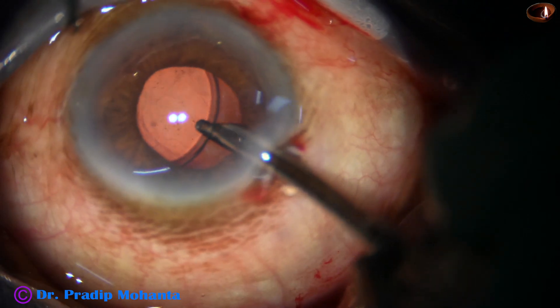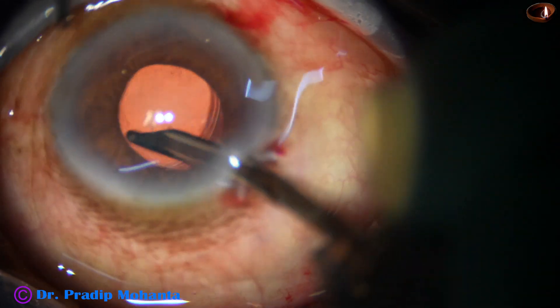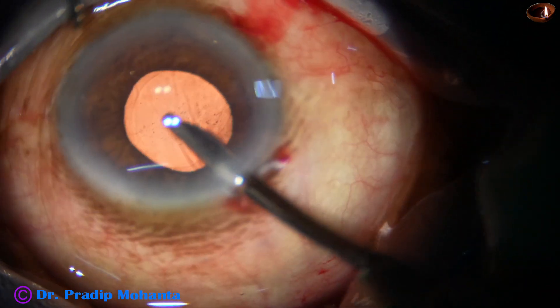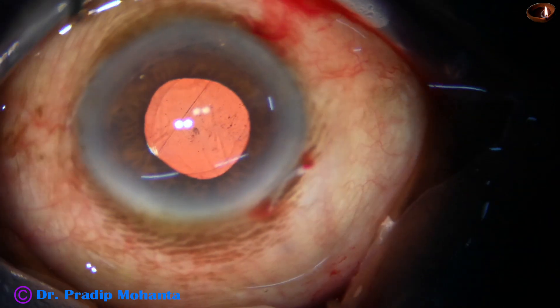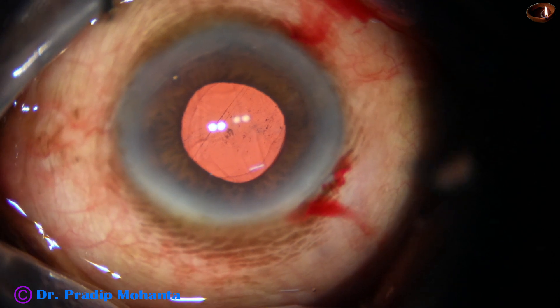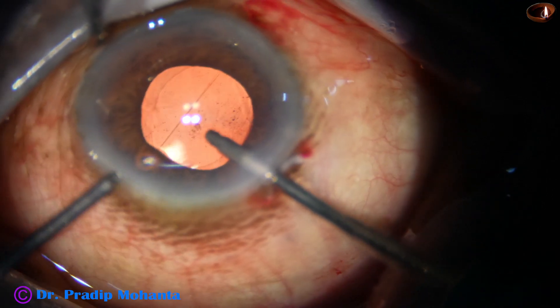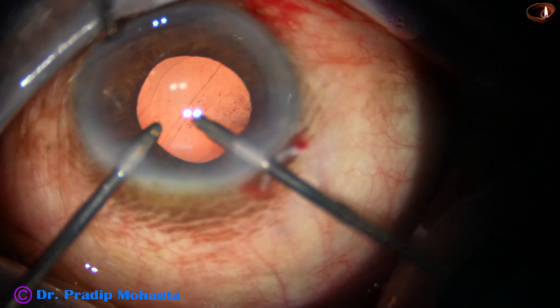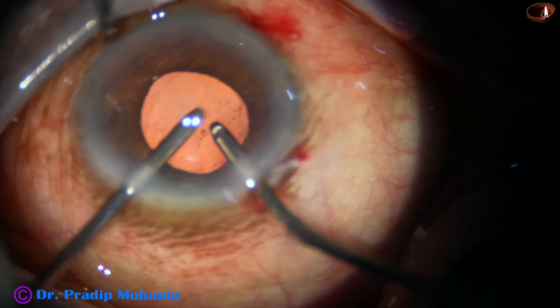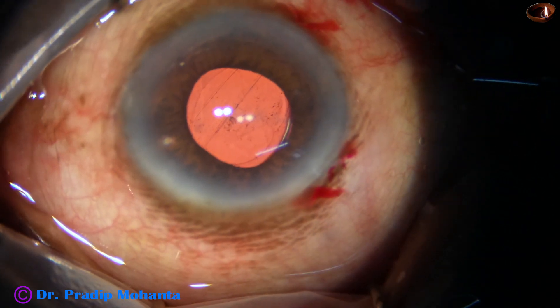Now is the time to clean the viscoelastic. First I use Simcoe for some time — irrigate the anterior chamber, irrigate the capsular bag, meaning I go behind the intraocular lens and irrigate the capsular bag, then aspirate the anterior chamber. About 70% of the viscoelastic comes out by these manoeuvres. Now I use the bimanual irrigation aspiration — irrigate for a few seconds, then irrigation and aspiration together, then place the irrigating probe behind the intraocular lens.